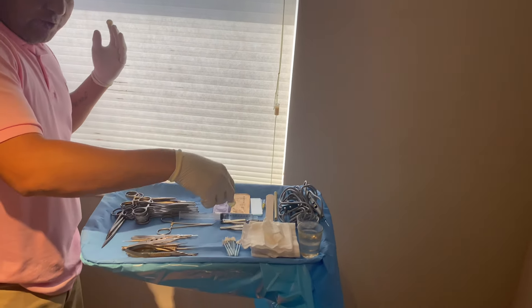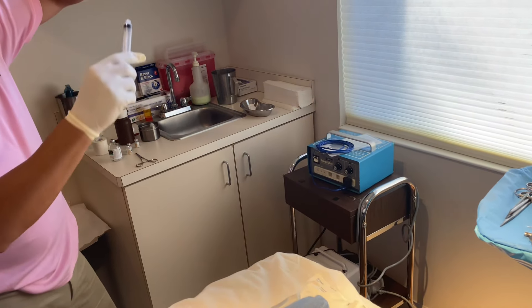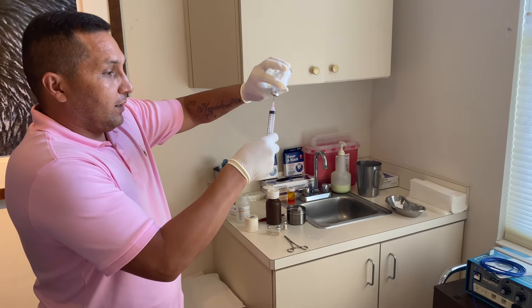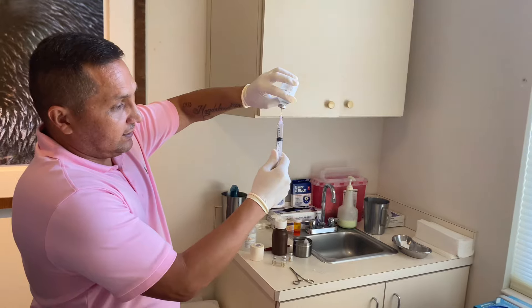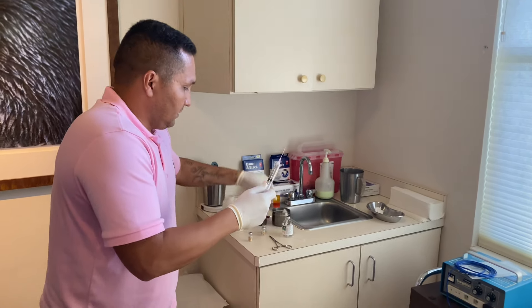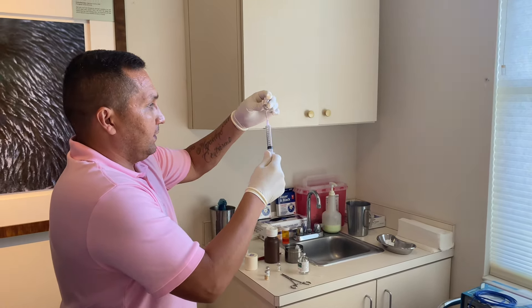Dr. Stein uses the slip tip to flush the vas deferens. Then I'll grab my luer lock with the contaminated hand, slip this on, and draw up the supplement. I already wiped this down with alcohol beforehand so they're ready. We'll do a 50-50 mixture — about 6cc's of 0.5% bupivacaine and then 6cc's of 2% lidocaine. Usually three bottles is enough to fill the syringe.